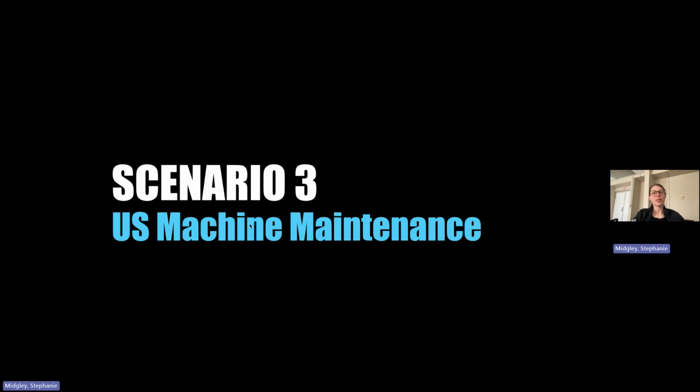So the next one is ultrasound machine maintenance. What do we think goes into the machine maintenance? And what stuff do you need? Software. Software as far as the machine making sure it's sending images over to the PACS system properly, it's getting the order properly. And you're wiping the machine every now and then to make sure the storage isn't too built up. And then hardware: they're clean, they're charging properly, probes don't have cracks, wires aren't frayed.